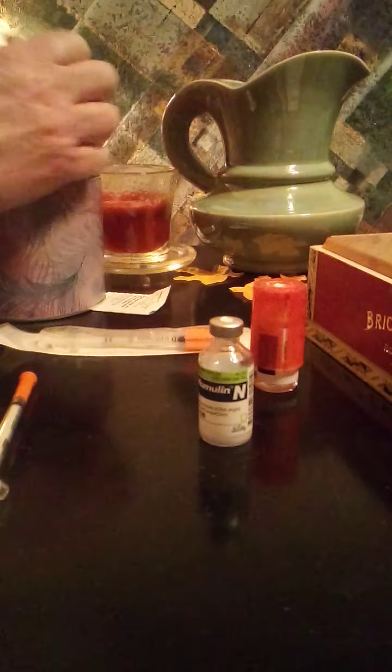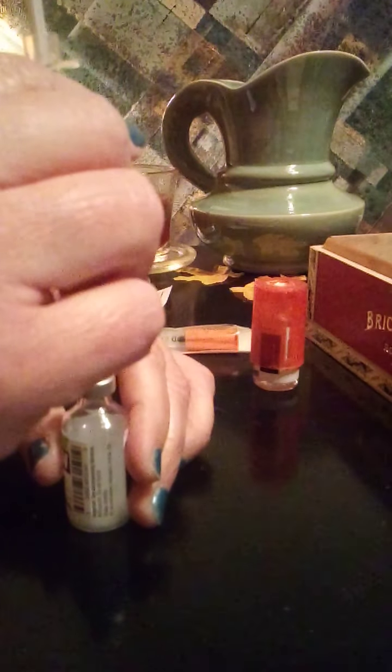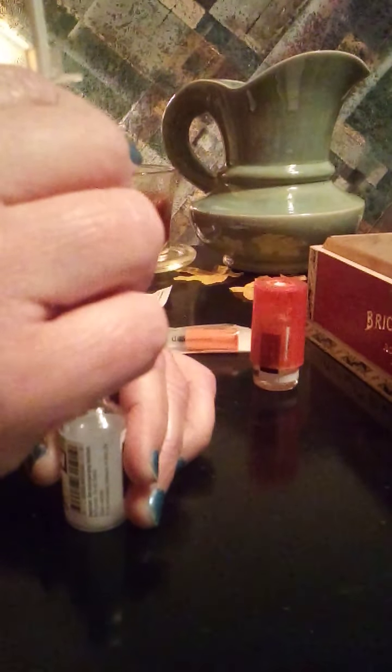I'm just going to go ahead and take the lid off of this. I usually have another container here, or I'll throw this part and this part in the trash. But I'm just going to put it in my sharps container today. Those parts do not touch anything biological, and they're not sharp. So I try to be conservative on how much I put in my sharps container, so that way I get to use it longer.